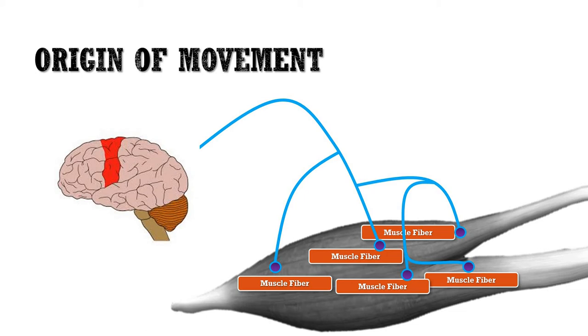And the nervous information is carried down from the motor cortex through the spinal cord to our efferent neuron or motor neuron, and that activity, or that action potential, I should say, is carried all the way down to the muscle fibers, and that will recruit the muscle fibers and cause them to release calcium, go through cross-bridge cycling, and so on, in order to produce force. So we're measuring with electromyography this nervous component.